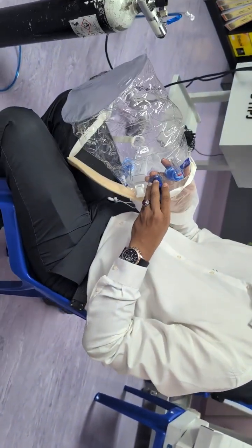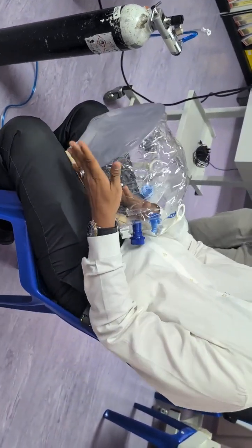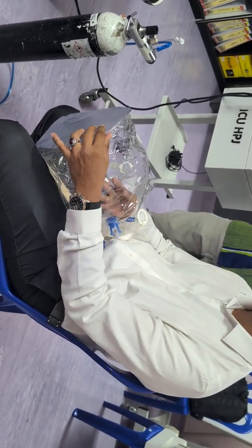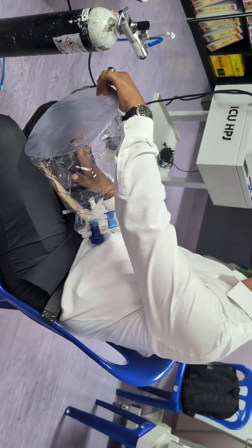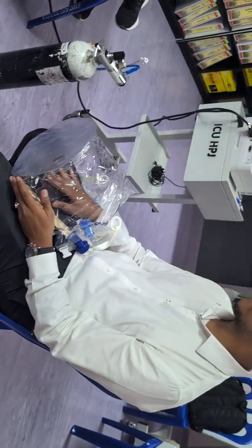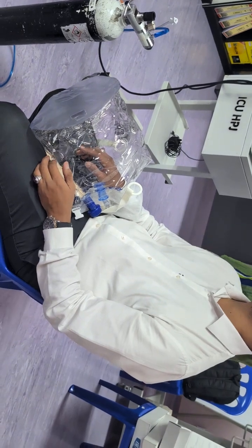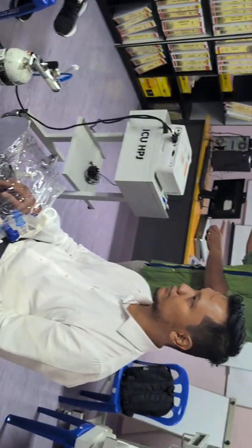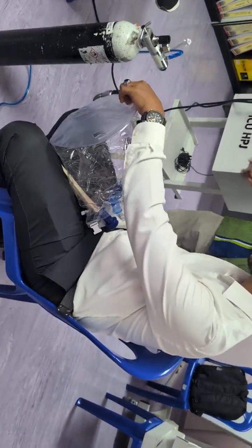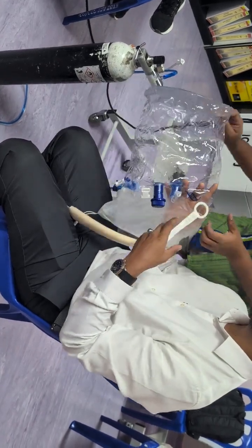So again, doctors, nurses, the most important thing which you need to understand, this is a CPAP mask. You remember high flow tadi is a CPAP mask of a different interface. This is also a mask of a different interface. Before we put on the patient, pastikan O2 is running, because patient dah lemas kat situ, and if we put it on without oxygen, dia lagi lemas. I keep on telling this because that's how we will learn, kan? Same concept.